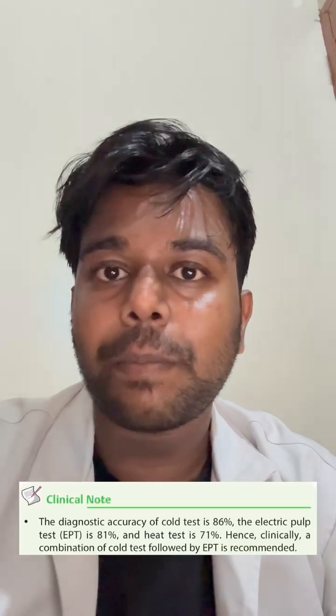The EPT is unreliable in testing immature permanent teeth, and the EPT is not recommended in concussed teeth. Usually, the diagnostic accuracy of the cold test is approximately 86% and EPT is around 81%. But for the heat test, it's around 71%.